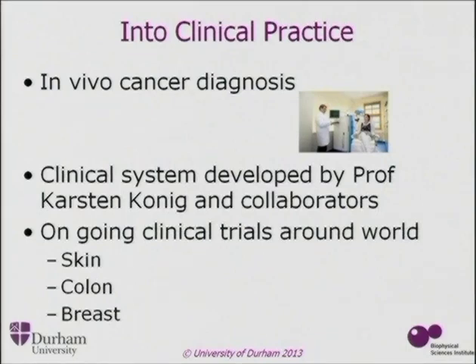They have built a clinical instrument that is being used for skin, colon, and breast cancer diagnosis. So this is using multiphoton, so it uses fluorescence, and it also uses harmonic imaging for building up and doing clinical imaging in practice. So this is taking the techniques that I've talked about here, and they are beginning to move into the clinic. Probably, for most applications, it's overkill. It's probably more than you really need if you can do it more simply. But there may be some examples.